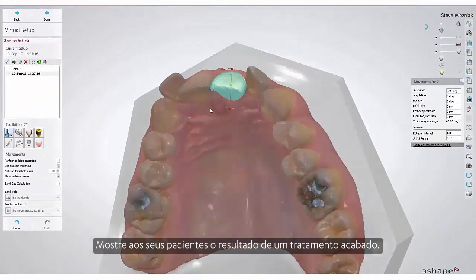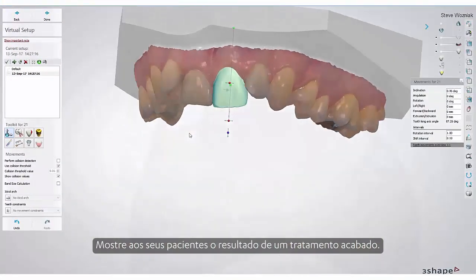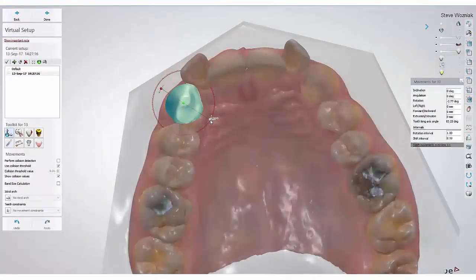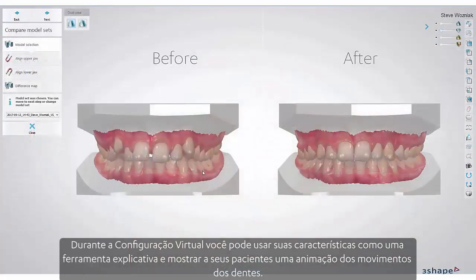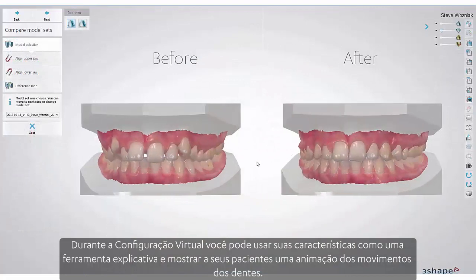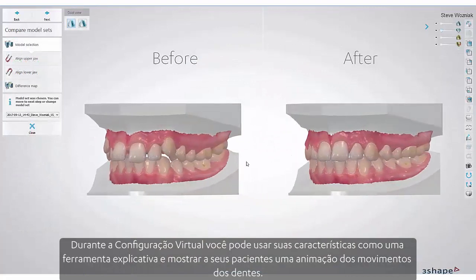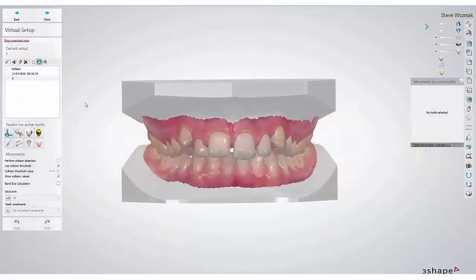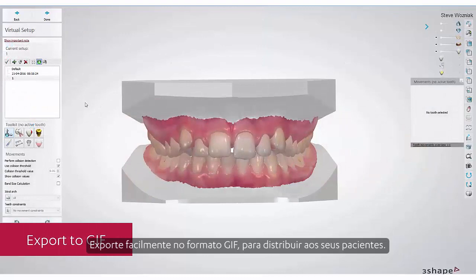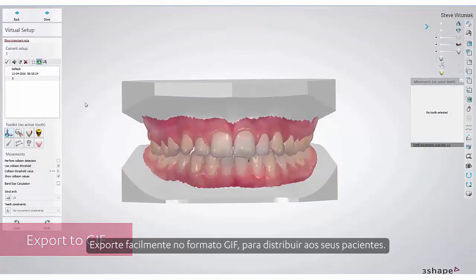Show your patients the outcome of a finished treatment. During the virtual setup, you may use its features as an explanatory tool and show your patients an animation of their teeth movements. Export this easily in the GIF format to hand out to your patients.